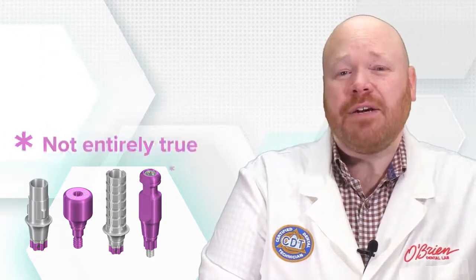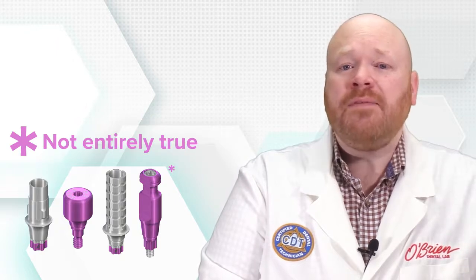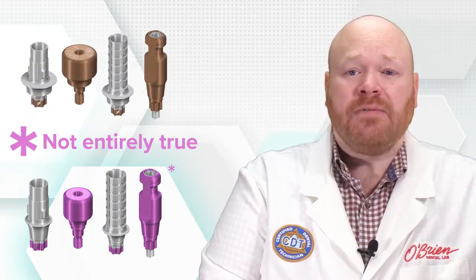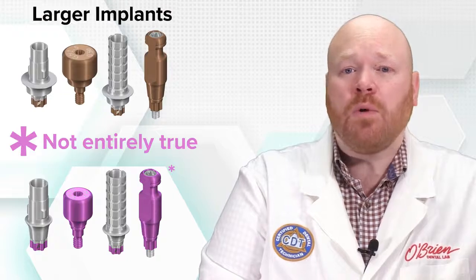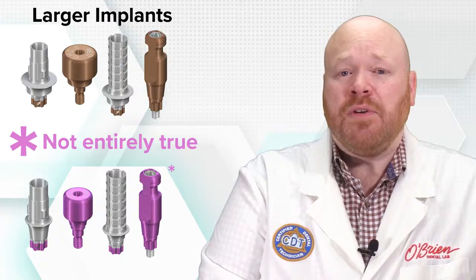But also that's not entirely true. In addition to the universal components, the BLX line features some additional parts that provide extra flexibility, but those only work with the larger diameter implants. And this is where there can be some confusion.